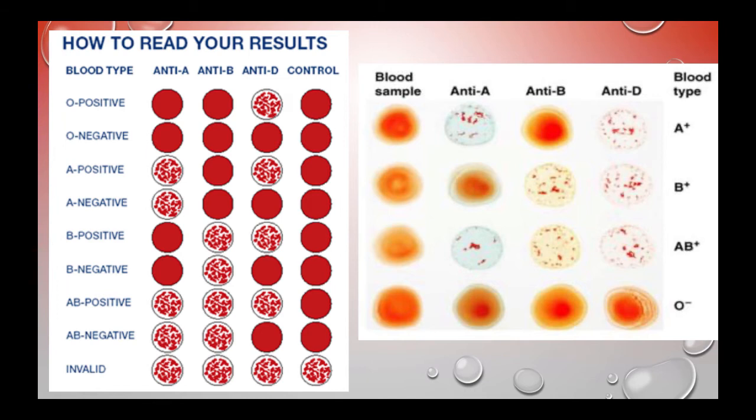Now I am a case where I'm O positive. So I am negative again for the A and B antigens. However, I do produce the Rh factor, and so I do have the agglutination for the anti-D there. Even that, again, because most people are Rh positive, I still get quite a few calls from the blood banks.